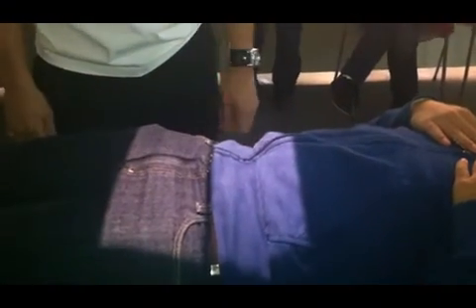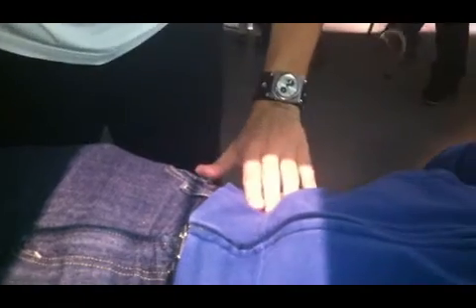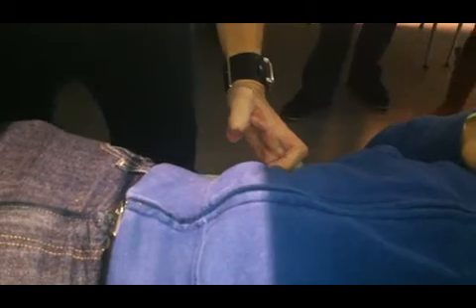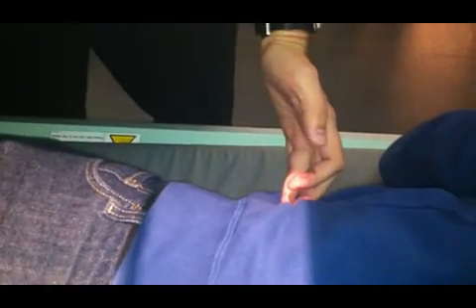AP pelvis? AP pelvis, yes. So what we're going to do is on this side here, you're going to find his ASIS first. Which is right here on top. And you're going to follow it around, just like the abdomen that we did second week of school or whatever, or third week, whatever it is, okay? Find the crest, which is right here. My finger is, make sure the light's just slightly above that, okay? Once it's above that, then you're pretty much set top to bottom here, okay?